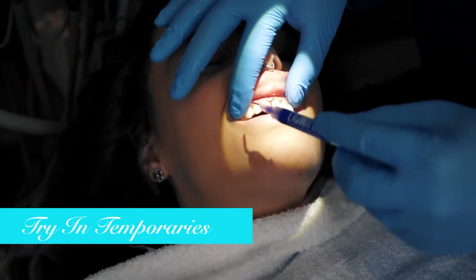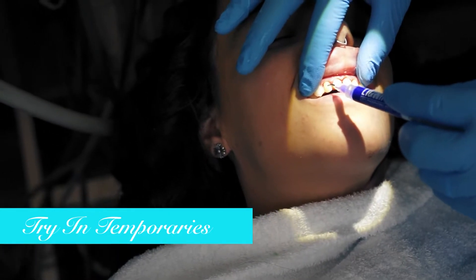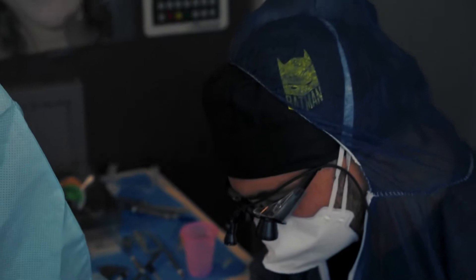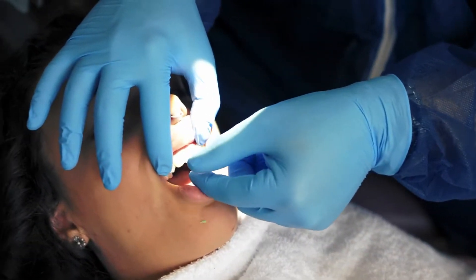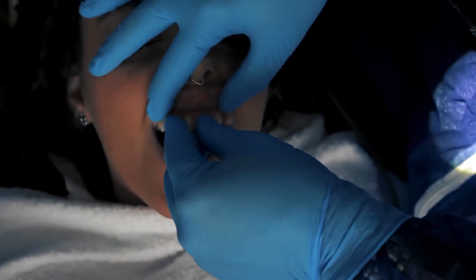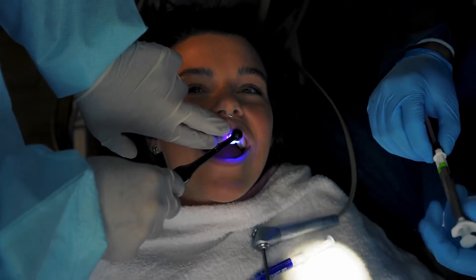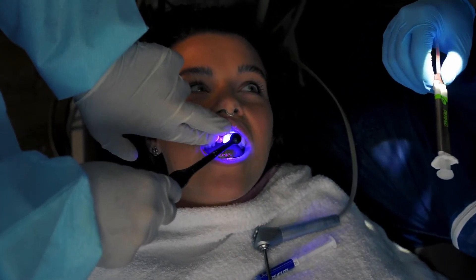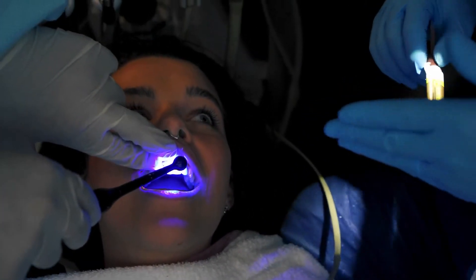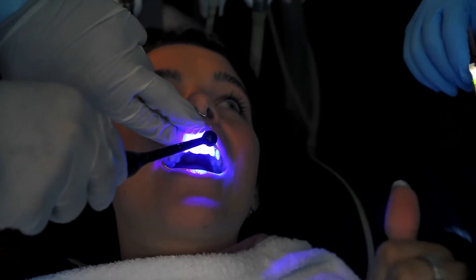So I'm going to glue these in. They're not super strong because in two weeks I want them to come out pretty easily too. You are clean as a whistle — let's go ahead and cement these in. They're just temporary, so your veneers will look 30 times better, but these should hold for the next few weeks and it'll allow us to know if you like the length, the shape. We can really learn a lot.